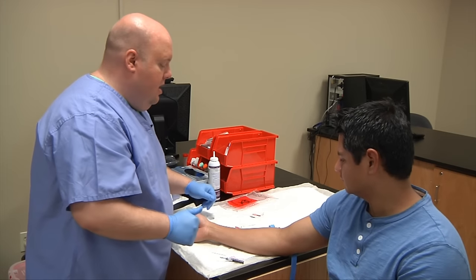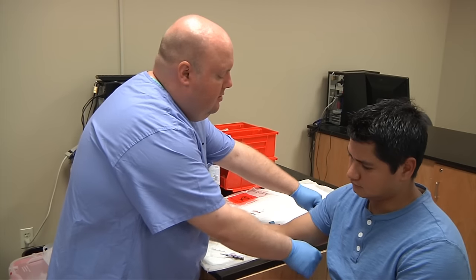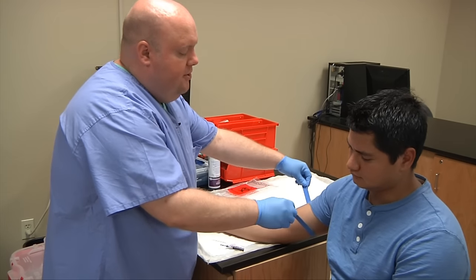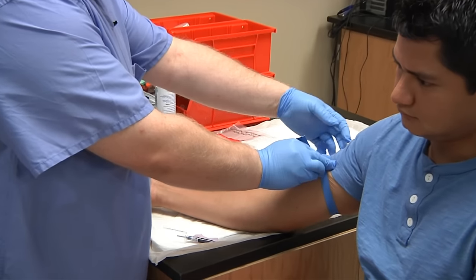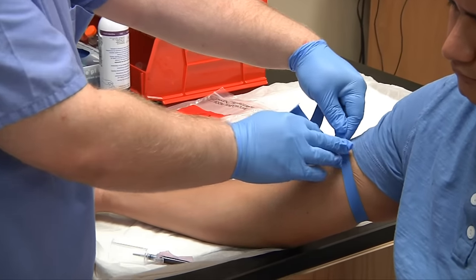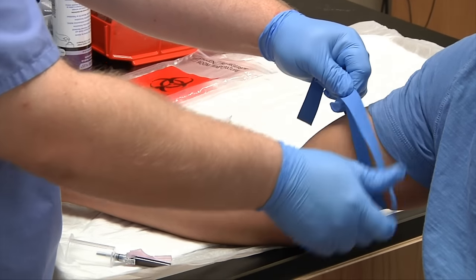Remember, the only thing that goes in the biohazard trash is sharps such as needles, used tubes, or any gauze or material saturated with 50% or more of blood. Everything else can go in the regular trash. So I've cleansed my patient, I have my needle assembled, and I'm letting the alcohol dry — that'll take about 30 seconds. I'll go ahead and reapply my tourniquet. Remember, you can only leave a tourniquet on for a maximum of 60 seconds.